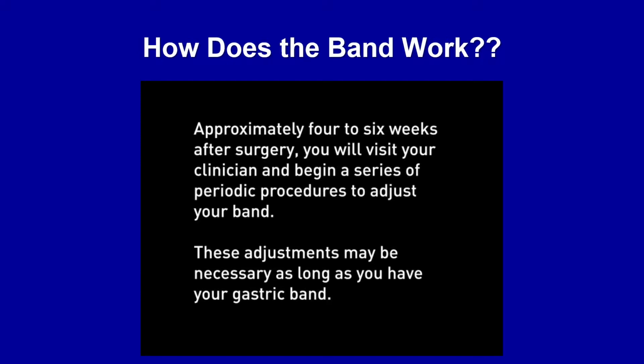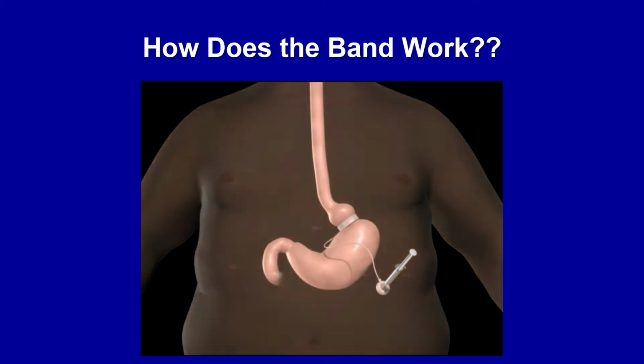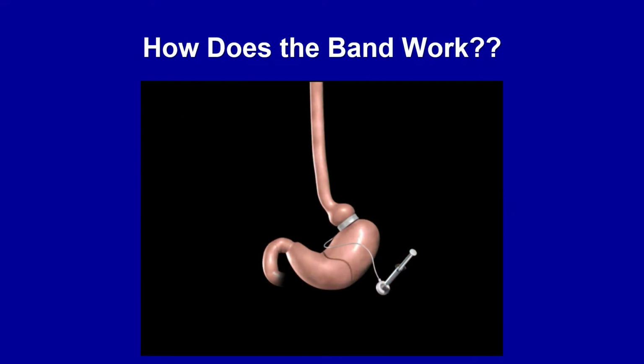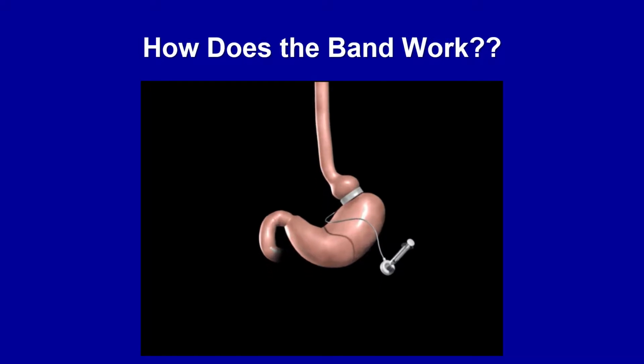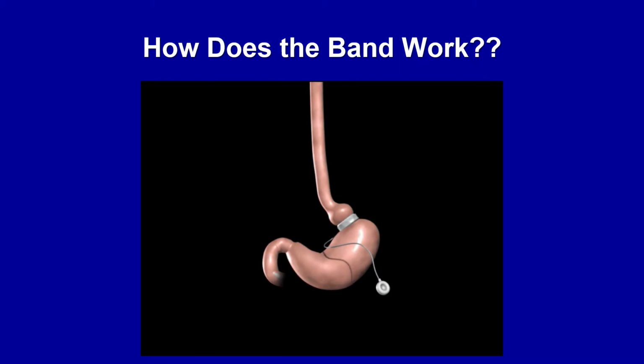So 4 to 6 weeks after your surgery, you'll come into the office and we put in a little tiny needle that's kind of like a blood drawing needle, only smaller, and squirt in a little bit of saline. And what that saline does is that it tightens down the inner tube, making the pinched part a little bit smaller, as you see in the video here. So basically what we've done is we've made the bottom part of our funnel a little bit tighter.